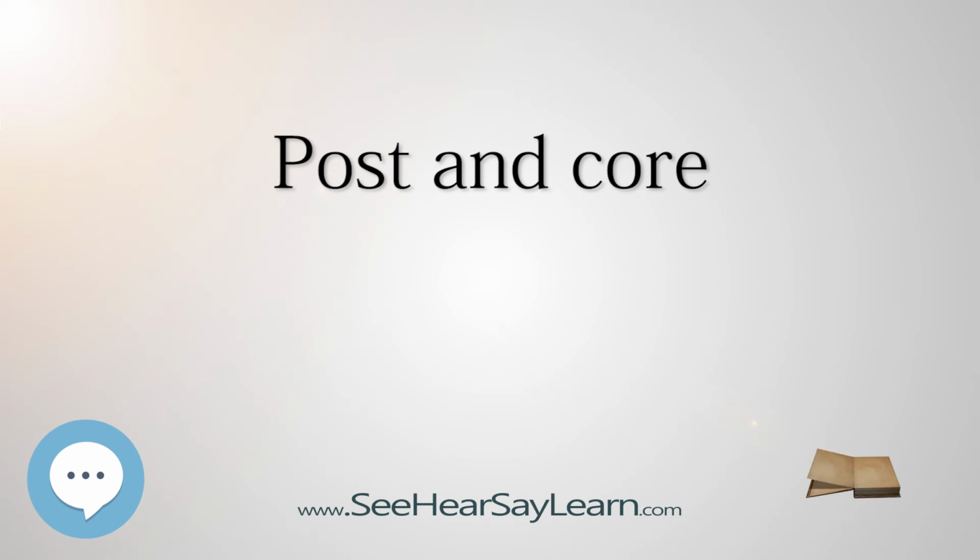A better alternative to posts on a posterior tooth is the use of an amalgam core restoration which extends down into the entrance of the root canal. Procedure. Post and cores divide into two main groups, prefabricated and cast. Both of these systems employ a post that is placed within the root canal of the tooth being restored. Thus the tooth must first be endodontically treated.